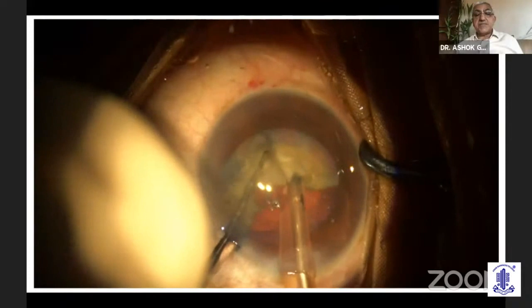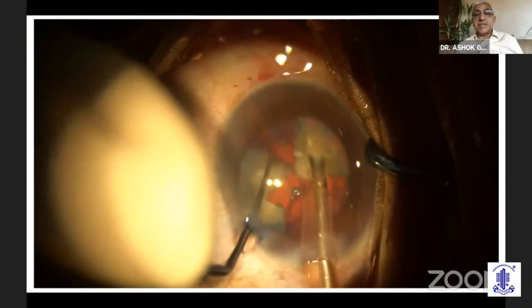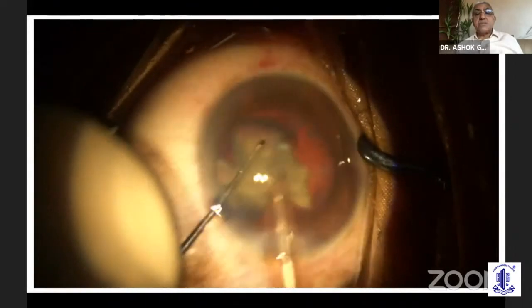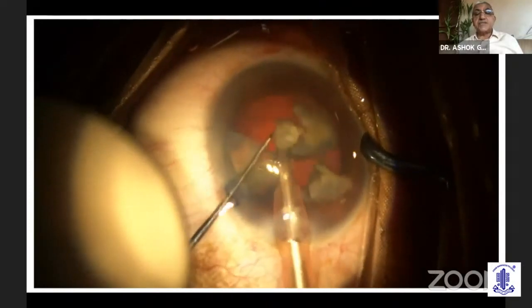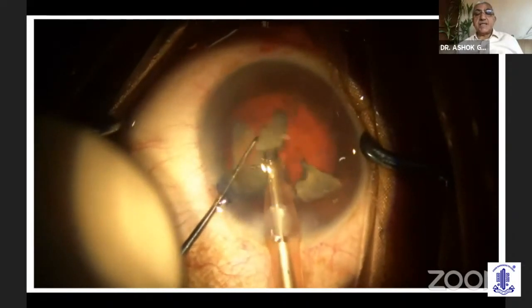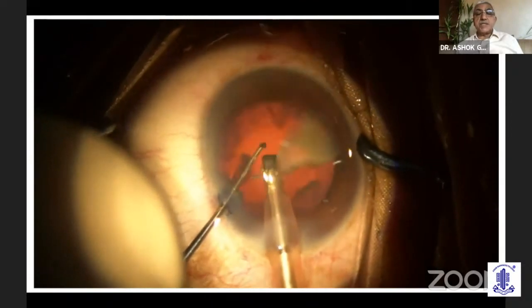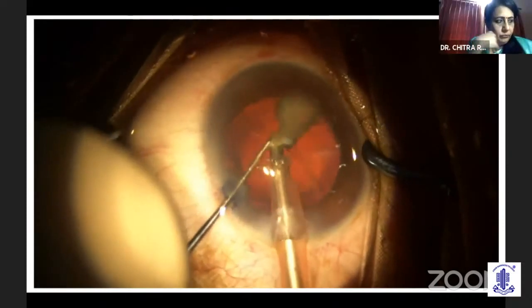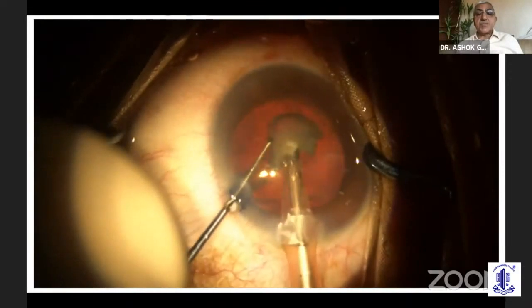So once the first half is done, I'm proceeding with the rest, making sure that the chamber remains deep. My parameters are not too high, and I'm trying to not use any more force. Now that it is debulked, the forces in the bag will reduce in any case. And I'm bringing all the pieces anteriorly, and in the iris plane, I'm removing the fragments. I reduced the parameters further for the last piece and went ahead and removed this last piece as well.